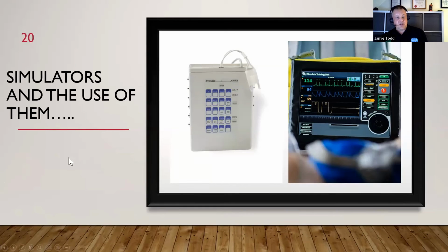Simulators can also be an issue. I'm not linked to any particular brand because there are now loads of brands of monitor simulation boxes you can attach to defibrillators to make them simulate stuff. The problem is that many of them have only got one type of each rhythm. So there's only one VF, or sometimes there are 2 or 3 VFs, but the educator only ever picks the one VF that comes up in the commonly used rhythm box.